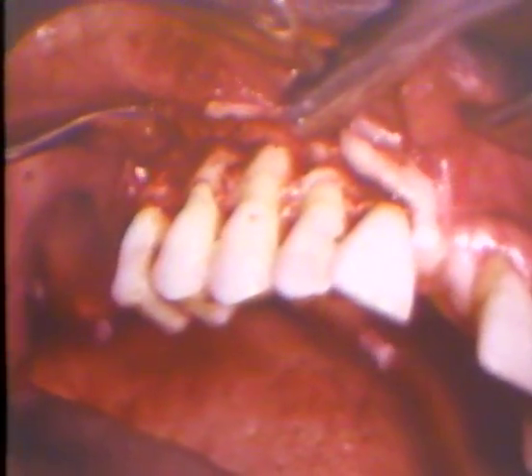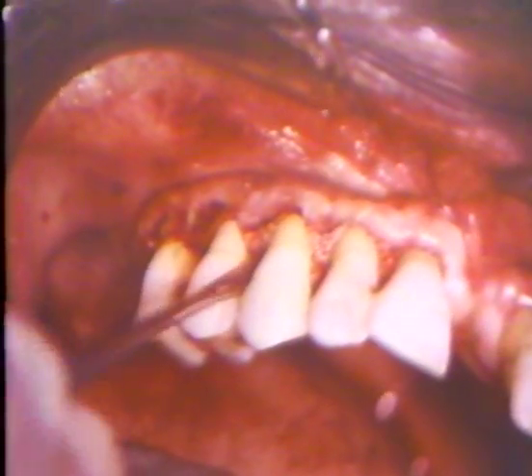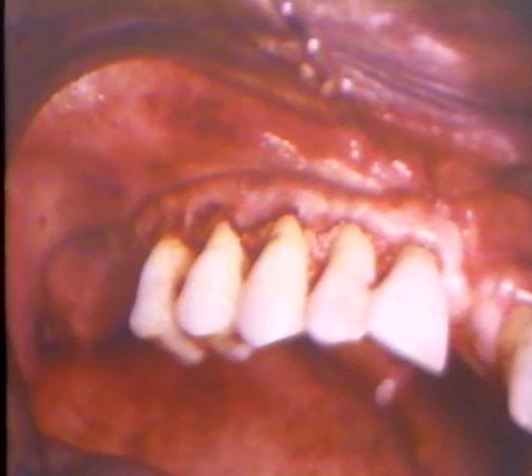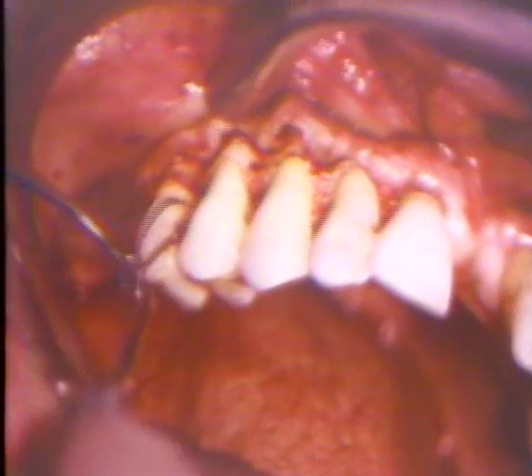Spray as you remove any fragments. The defect is seen between the 2 premolars on the buccal. Clean out the soft tissue fragments with a curette. This pocket will be eliminated by the use of hand and rotating instruments. The instrument now being seen is a curette, removing fragments of tooth left.